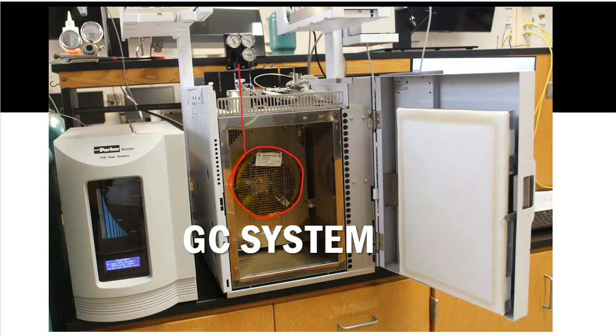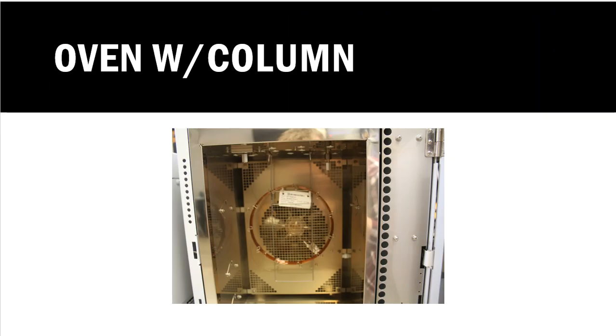All right, so if I zoom in a little bit closer, here is the oven door, and you can see maybe that column on the inside a little bit more. This column is made of glass, believe it or not, and it is very thin and very narrow. So how narrow's narrow, Tracy? Okay, well, narrow means about the size of a hair strand.